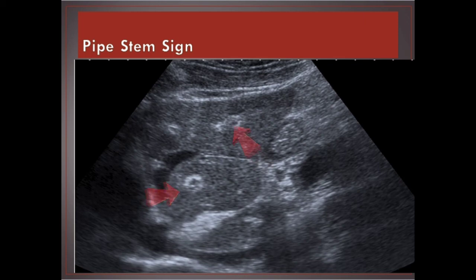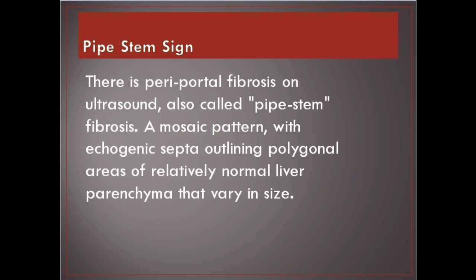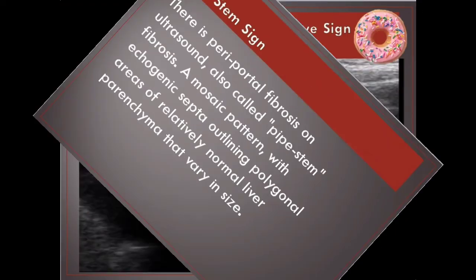Pipe stem sign. There is periportal fibrosis on ultrasound, also called pipe stem fibrosis. A mosaic pattern with echogenic septa outlining polygonal areas of relatively normal liver parenchyma that vary in size.